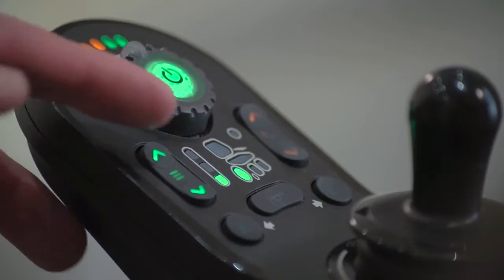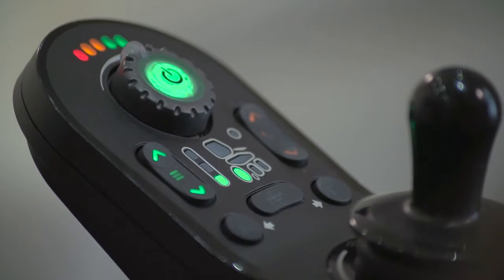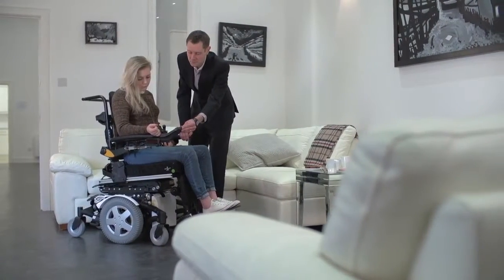The chair symbol features an illuminated drive wheel. Green and steady means drive at full speed. Green and slow flashing means the speed is limited due to seat function or an inbuilt sensor.